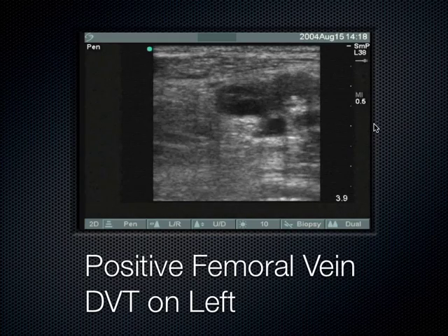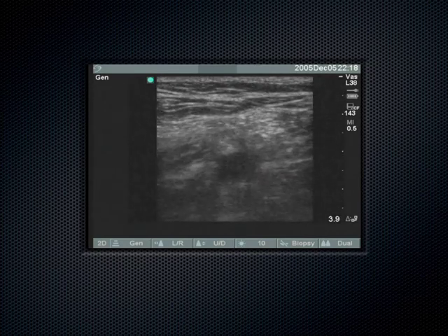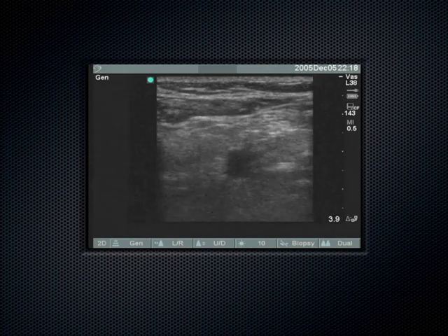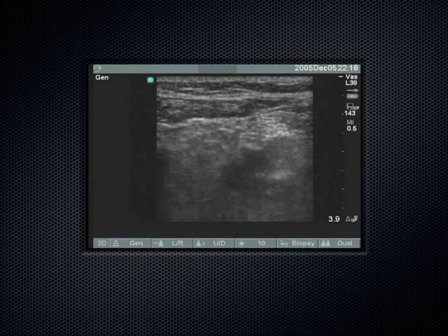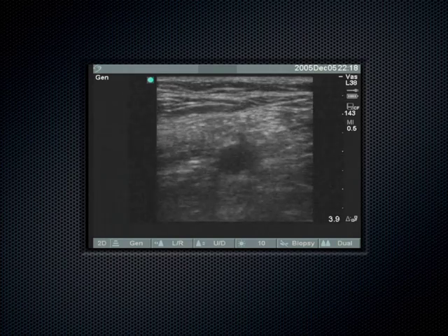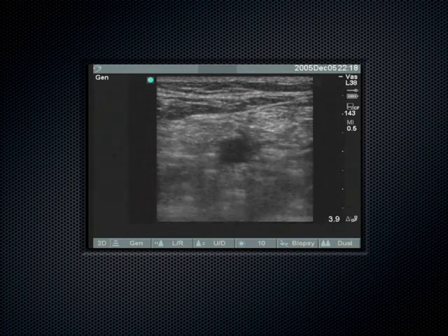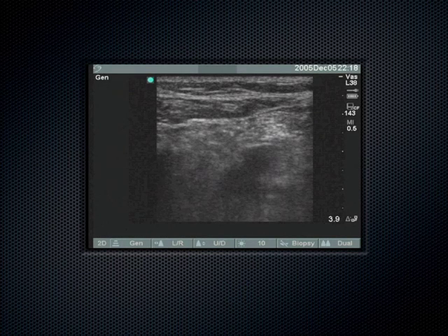Okay? Now, how about this one? What's going on here? There's another pitfall. Where are we? Hard to know. Turns out, now you know. See that? This kind of gets at the Frank Netter drawing a little bit, actually. Interesting, after I told him that you don't see this. I'm going to pause it when it becomes clear where we are. So we're pushing right there, and then there. So this is the popliteal fossa.